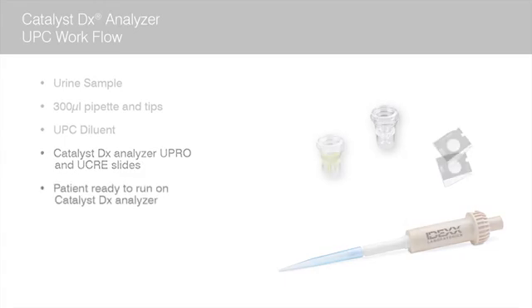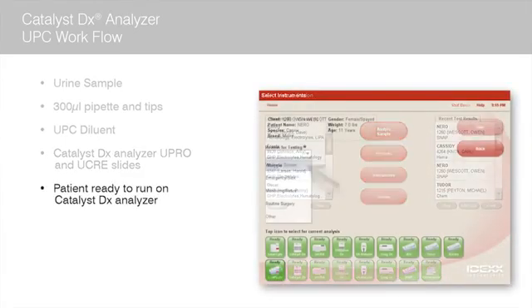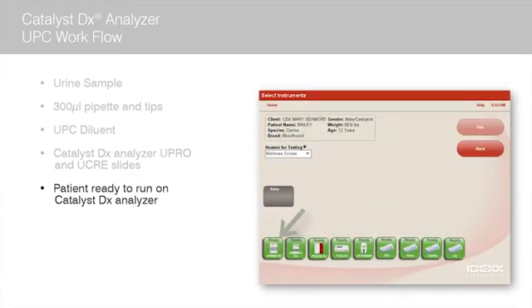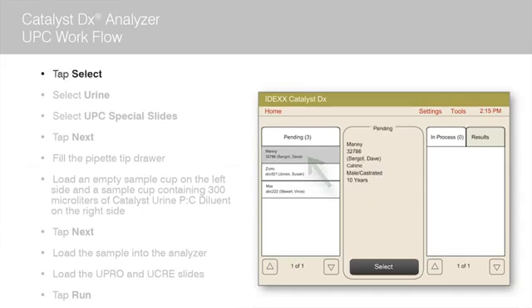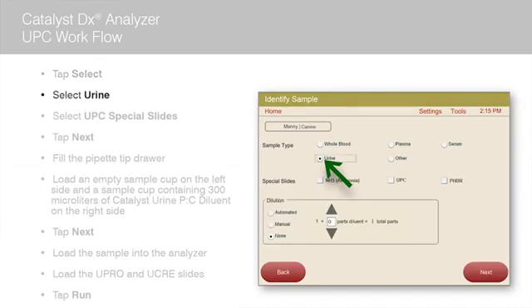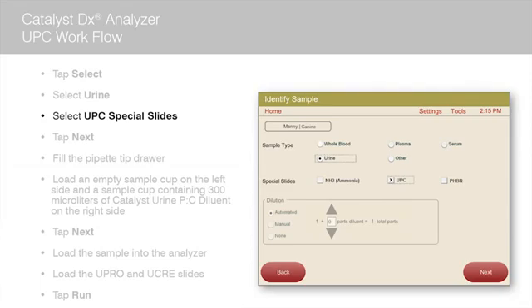For our purposes today, we have already collected the sample and initiated the run on the IVLS. Once the patient's name appears on the pending list on the Catalyst DX home screen, tap the patient name and tap select. Select urine as the sample type. Select the UPC special slides checkbox. When this checkbox is chosen, the automated dilution option is selected automatically. Tap next.